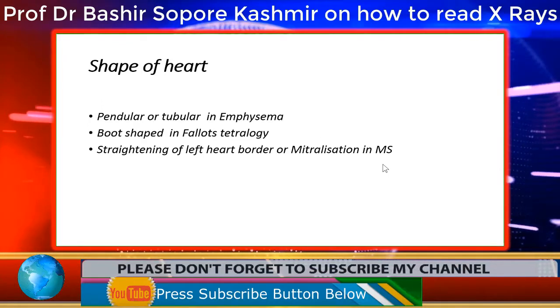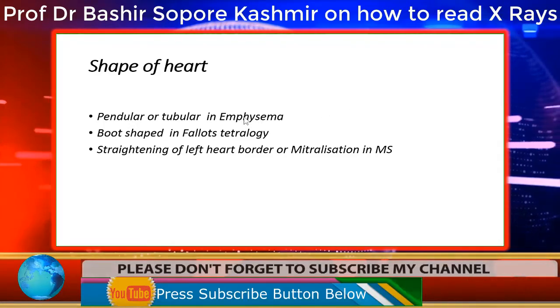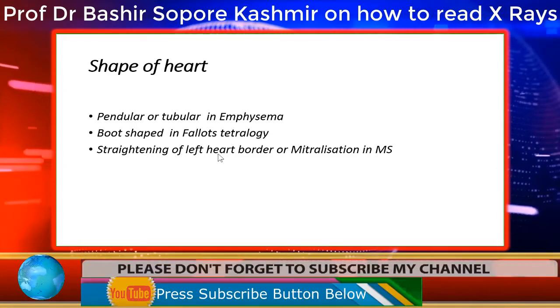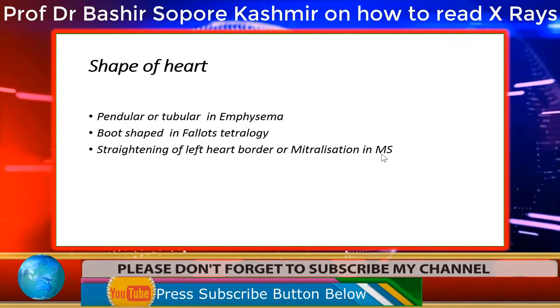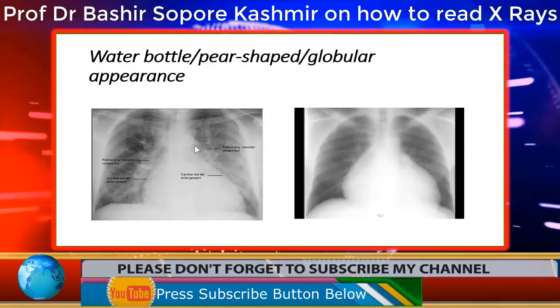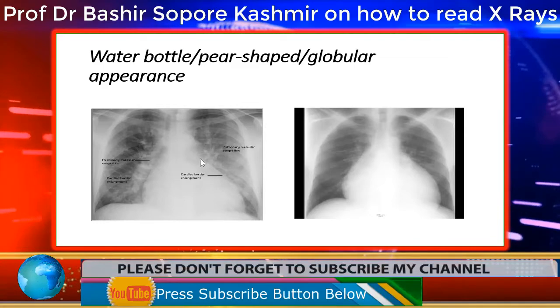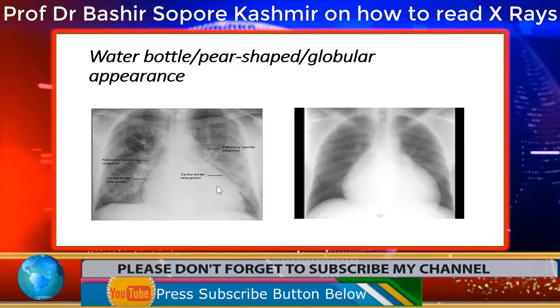Now, shape of the heart. The shape of the heart can be pendular or tubular as in emphysema. It can be boot-shaped in tetralogy of Fallot, or there can be straightening of the left border, which is also called mitralization, that happens in mitral stenosis. Now, you see the different shapes of the heart. This is called water bottle, pear-shaped, or globular appearance. So you can see here there is a cardiomegaly, but it is a water bottle or pear-shaped appearance.